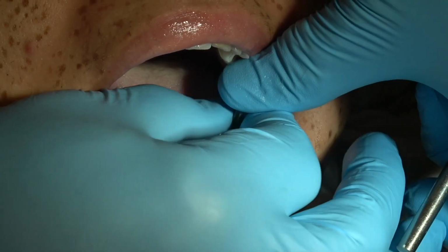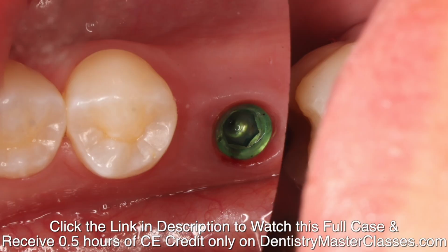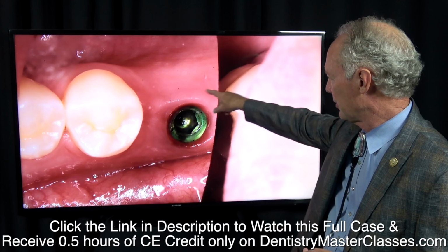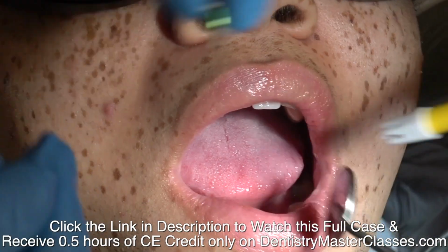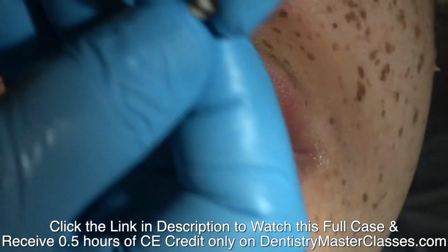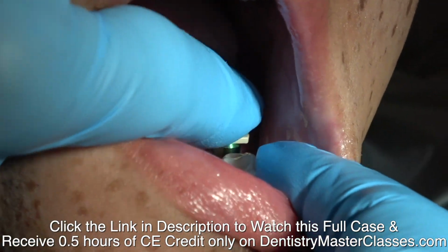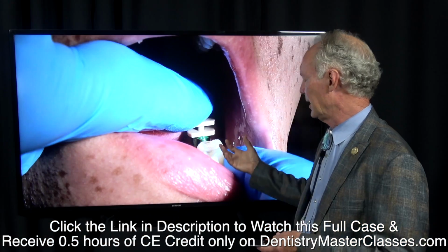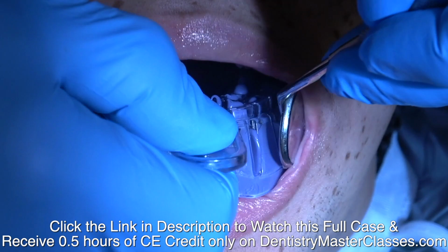So I've not anesthetized the patient. I'm unscrewing the healing cap. You can look how good that emergence profile looks. We've got good clear margins because we've had that healing cap on for 3 months. Then I love this. This is the BioHorizons impression coping and implant system. So this just snaps into place, and then try the tray in.